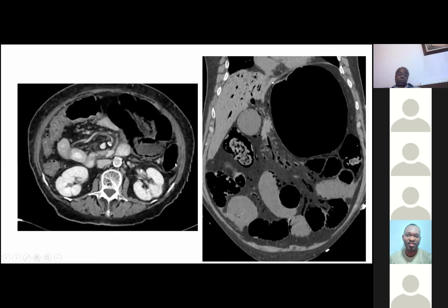Yeah, the point about the X-ray was a valid point. The additional value of the X-ray in this case would be to look for a bowel perforation, and I agree 100%. Acute mesenteric ischemia was a suspicion based on the X-ray and the clinical scenario. On the basis of X-ray alone, you couldn't actually diagnose mesenteric ischemia, but it was a suspicious scenario. You can sometimes have gas in the bowel wall and gas in the portal veins in patients who do not have mesenteric ischemia. So it is quite important to link the X-ray findings to the clinical history.